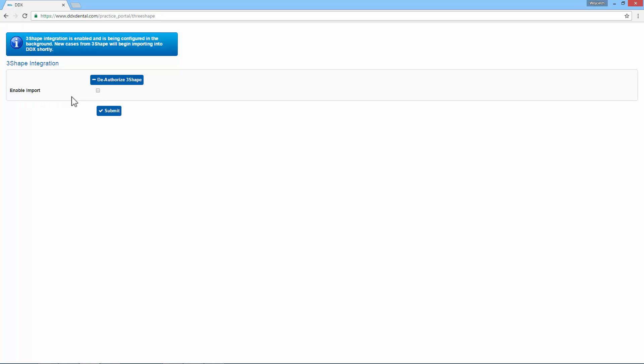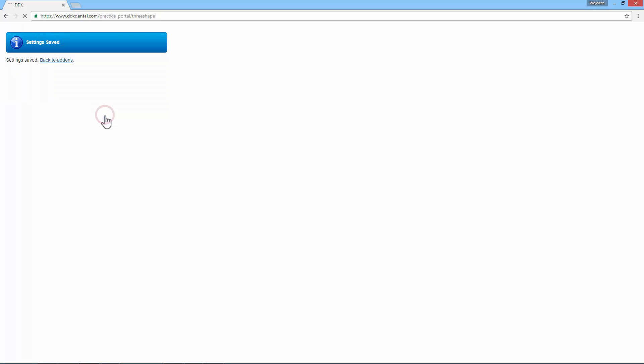Make sure that the Enable import option is checked and click Submit. Now you can go back to Add-ons.